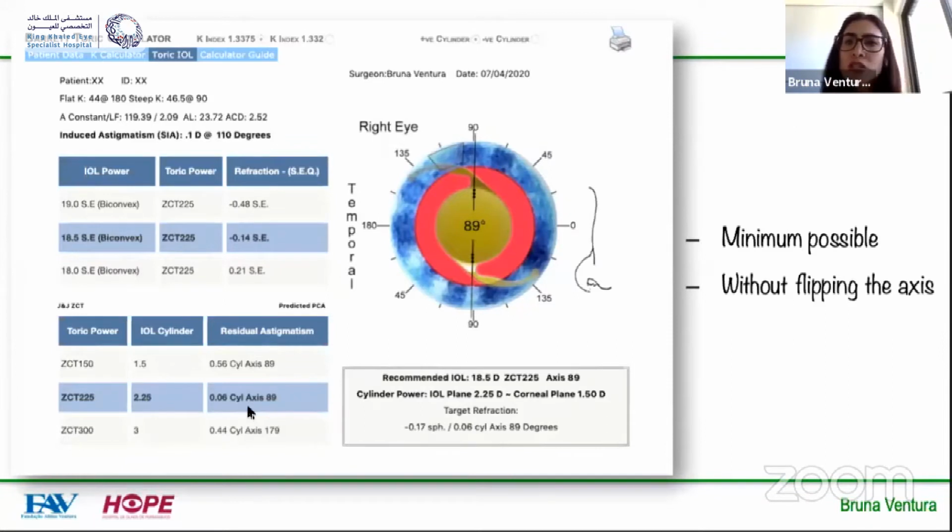We have patients that are completely active as if they were 40 or 30 years old. So the quality of vision is very, very important. Instead of aiming at half diopter after surgery, we should be aiming at leaving them 0.1 diopters, because if that's a little bit more after surgery, it will still be very small and not interfere in their quality of vision.